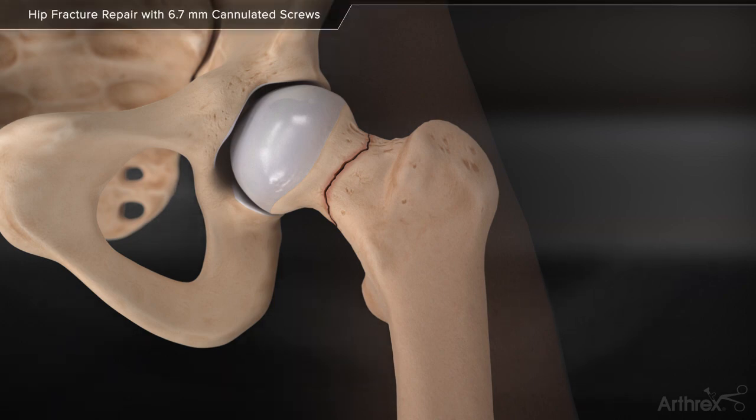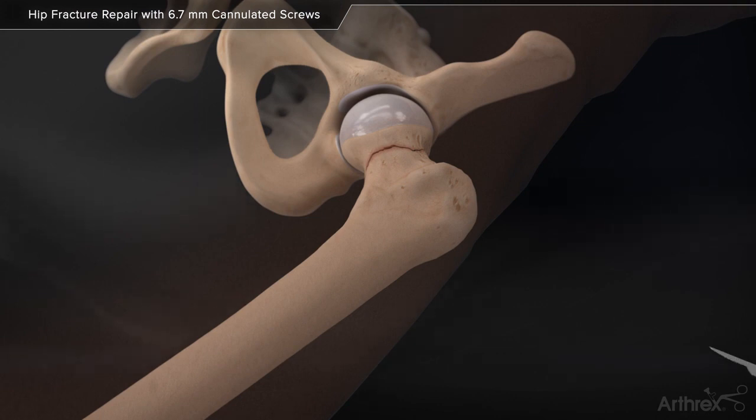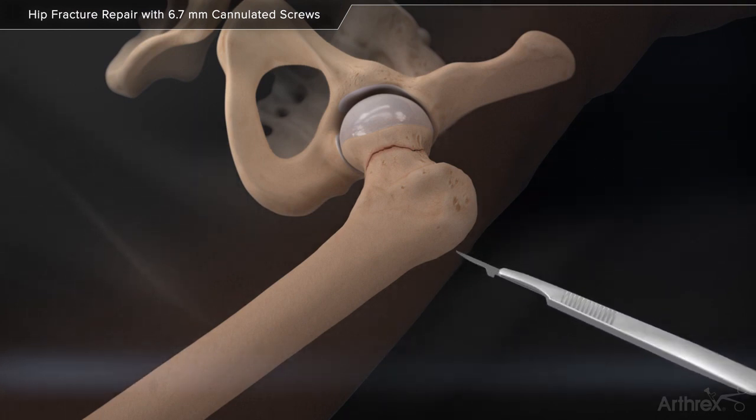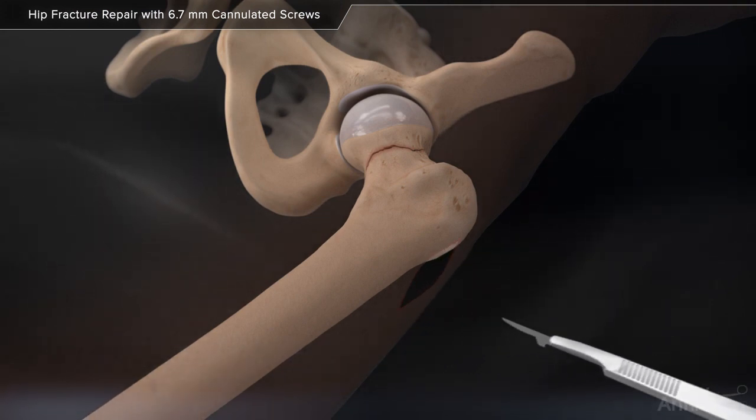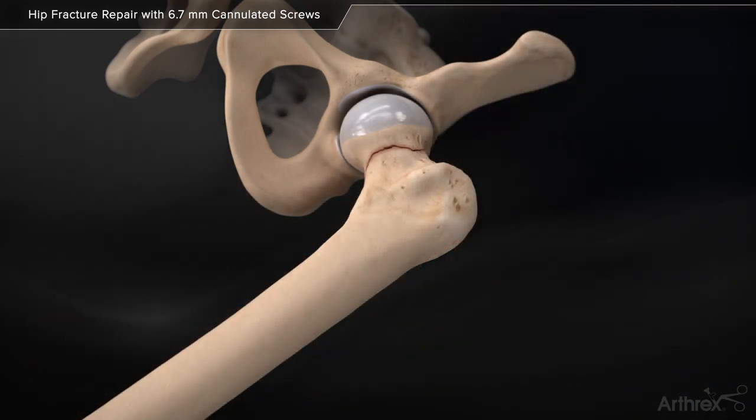The Arthuric 6.7mm cannulated screw system features low-profile screws with large thread-to-shaft differential, resulting in deep threads for maximum pull-out resistance. The screws are also self-drill, self-tapping, with type 2 anodized titanium.